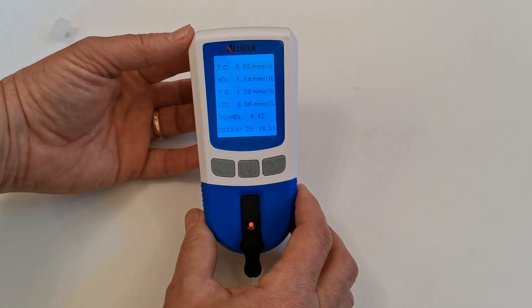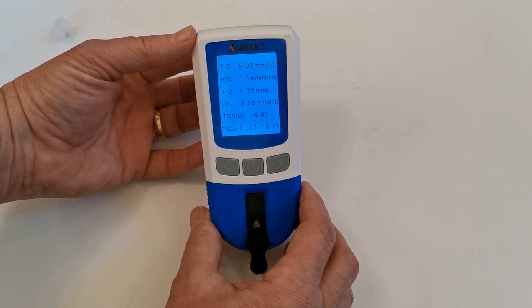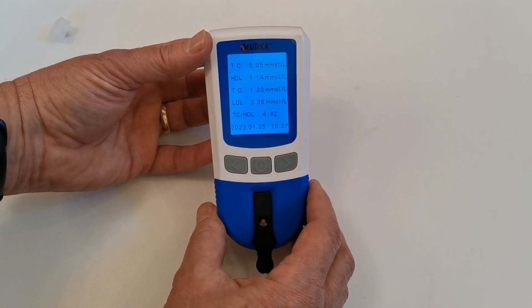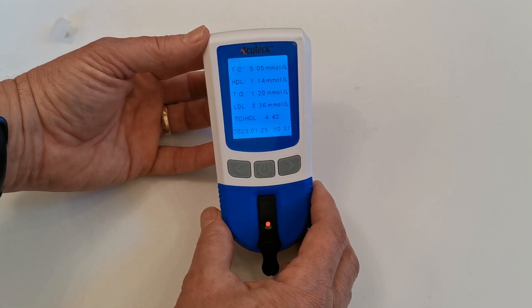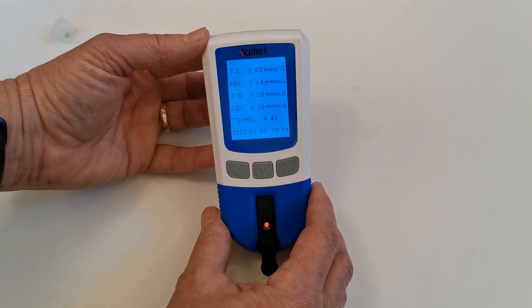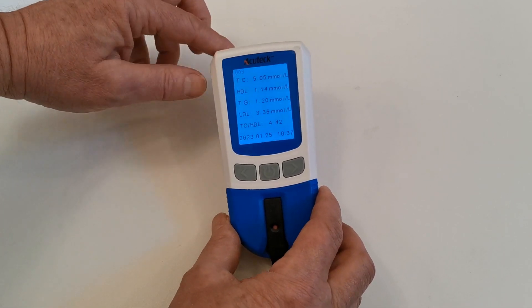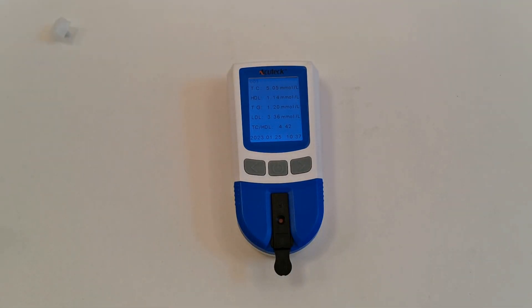You want triglycerides under 1.37. My LDL cholesterol, which is the difference between the total and HDL, is coming out at 3.36 millimoles, which isn't bad. The total cholesterol to HDL ratio is 4.42, which is good — you want that to be under 5 for a low cardiac health risk score. There's lots more information in the frequently asked questions on our website about how to analyse your results and when and how often to use the total cholesterol and differential meter system.